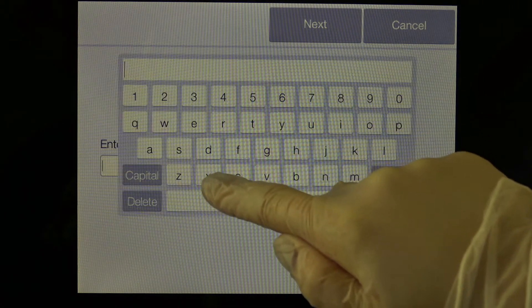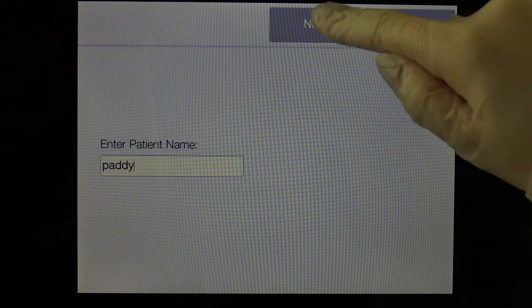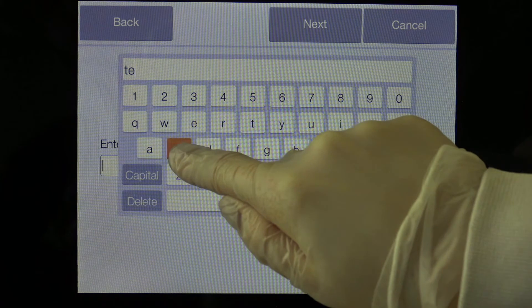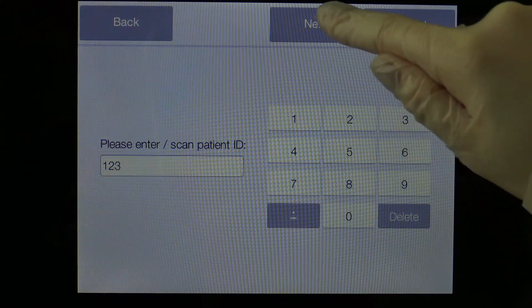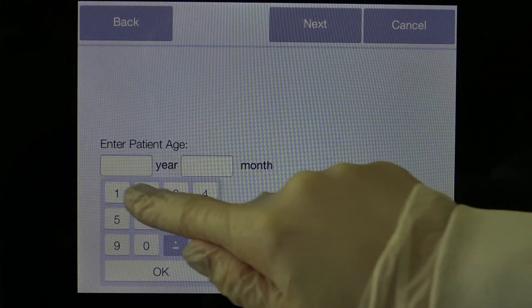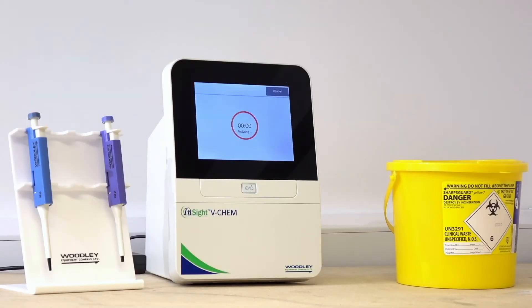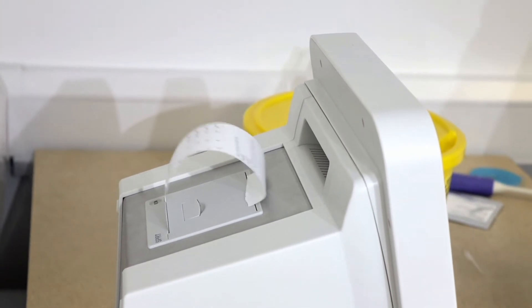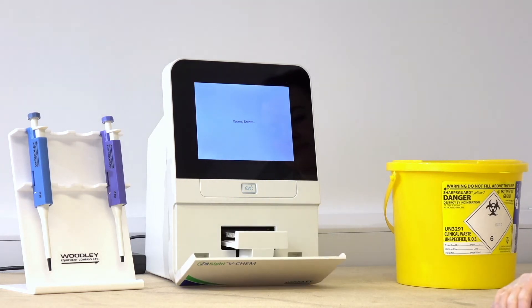Enter the patient information. Different fields can be enabled or disabled in the settings menu. Once analysis has completed, the results will display on screen and will automatically print out on the built-in thermal printer. The used rotor can be removed and disposed of in a clinical waste bin.